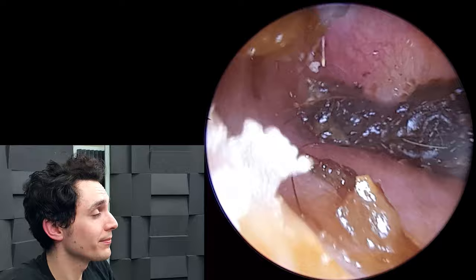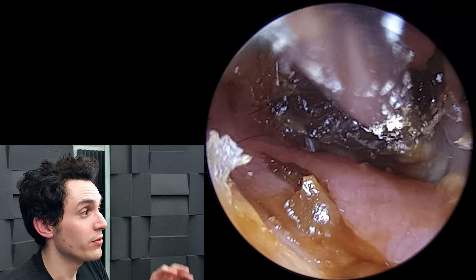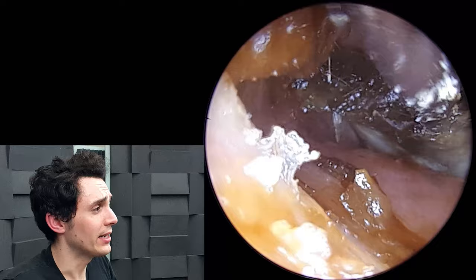When everything's cleared up you'll see just how deep this recess actually goes. I was loosening it up and now we're finally getting some movement. On the underbelly of this huge piece of wax you'll see white splodges — again, that's desiccated dead skin. Now we can finally see just the gigantic plug in its own right.